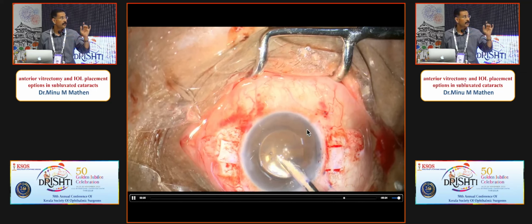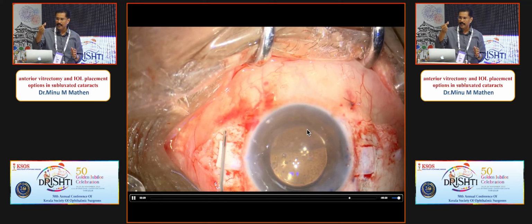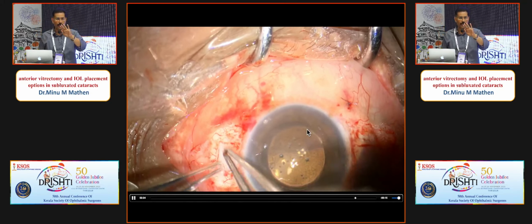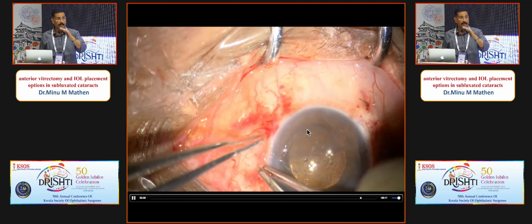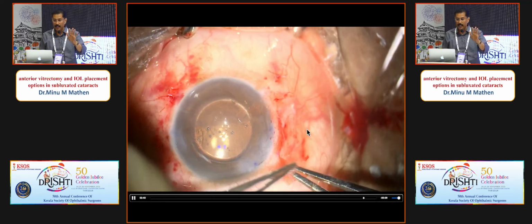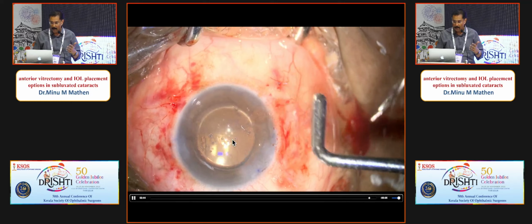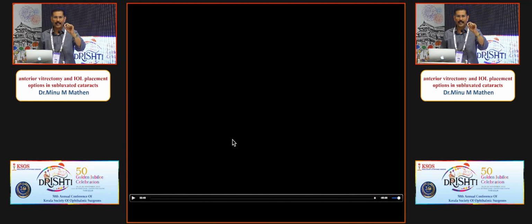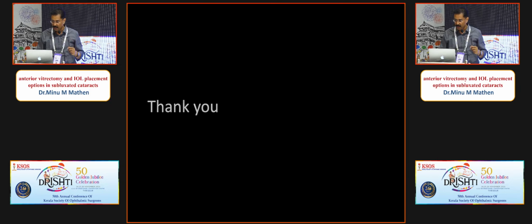And nowadays I make a scleral flap thicker than normal because it's a slightly thicker part of the T, and it should not erode out through. So it doesn't erode if your section is nicely closed. It doesn't leak. You don't have to close it for the leak part of it, but then use glue or suture and close it. This is also less time consuming. In my part, the tucking of the haptic is a little cumbersome for me. This is giving me much better tucking of the haptics, and thank you very much for listening.